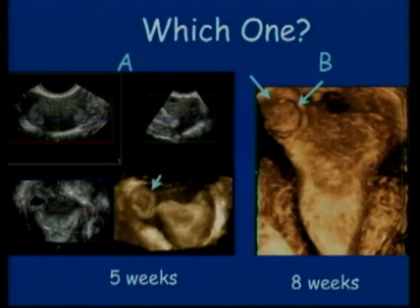Okay, the next case. This is a patient that it's not an anomaly, but she comes into the ER with bleeding. Rule out ectopic pregnancy. This is a 3D picture showing the coronal through the uterus, and then where they've taken it from a transverse view, and then here is the multiplanar picture of C-plane through the uterus with this abnormality right here.